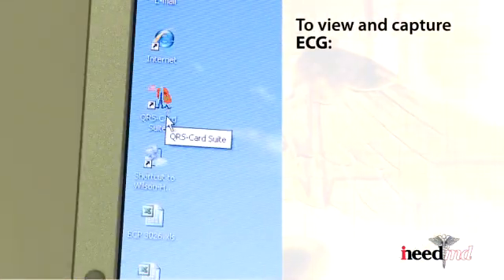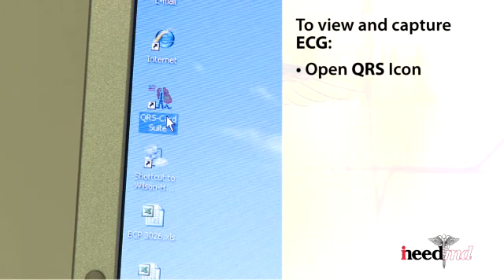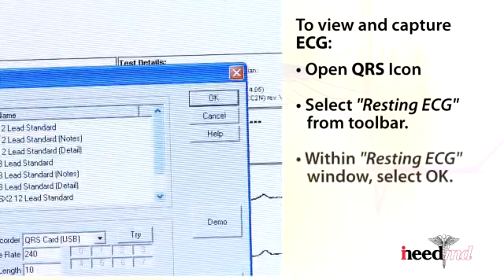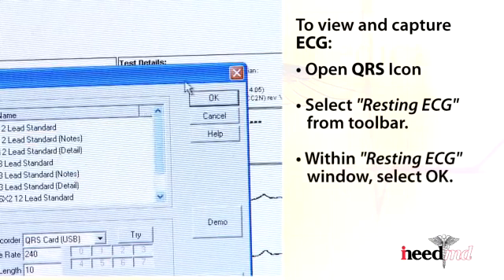To view and capture the ECG, open the QRS icon. Select Resting ECG from the toolbar. Within the Resting ECG window, select OK.